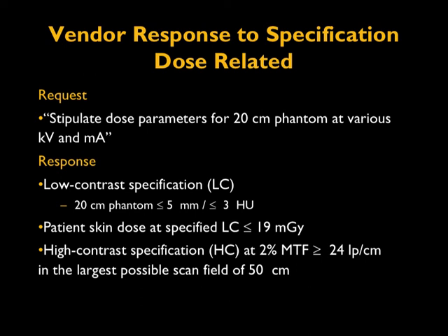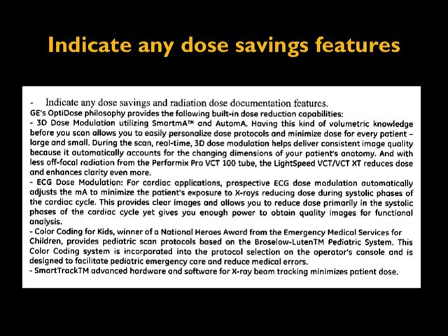Here is a request asking what the dose parameter is for a 20 centimeter phantom at various tube voltages in kV. It's basically asking what the radiation dose is for a particular specification, and here's the response. And here's a response from a particular manufacturer indicating the dose saving features.